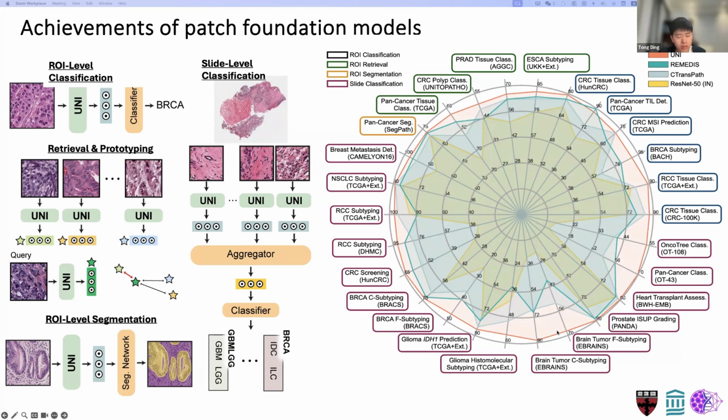As a further step, we can align these models to text so that we can build models like PLIP or CONCH from our lab to enable zero-shot and cross-modal search capabilities. Even more, we can do captioning at the patch level. But we still need techniques like MI-Zero or others to make it possible at the slide level.